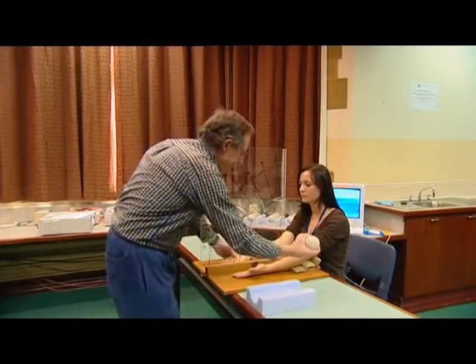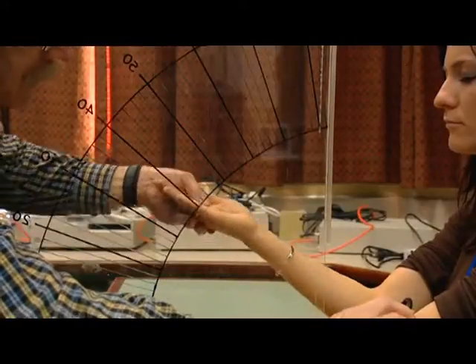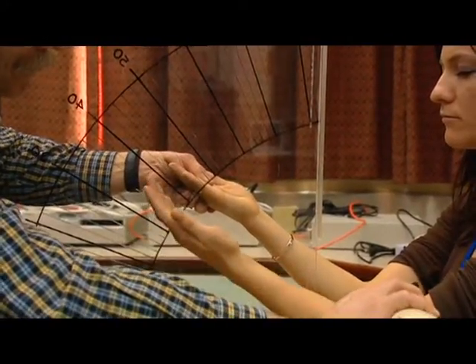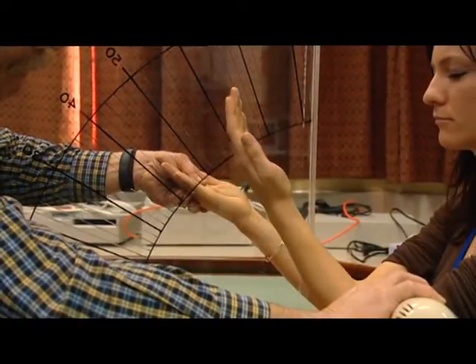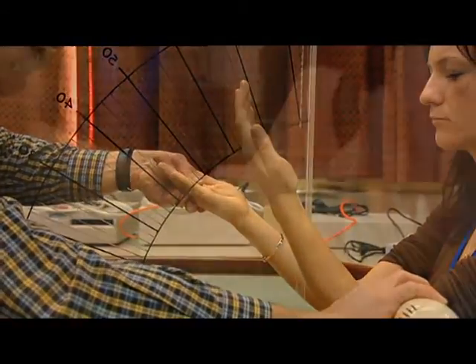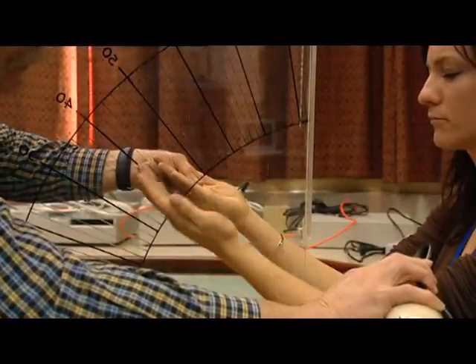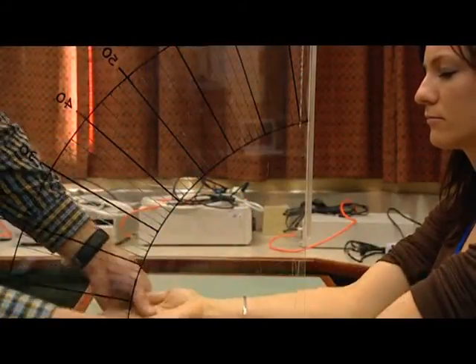We use the Niagara hand massage unit to elicit a reflex in a tendon. We apply the massage unit to the tendon and the continuous train of vibrations elicits a contraction in the muscle associated with that tendon, enabling us to demonstrate to students the pathways involved in those reflexes.